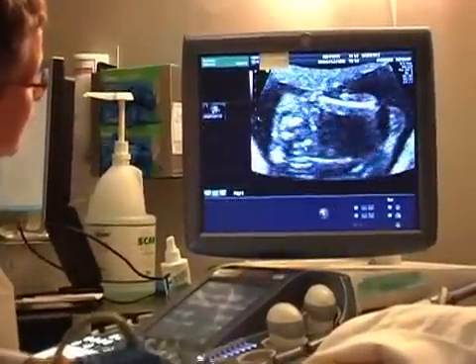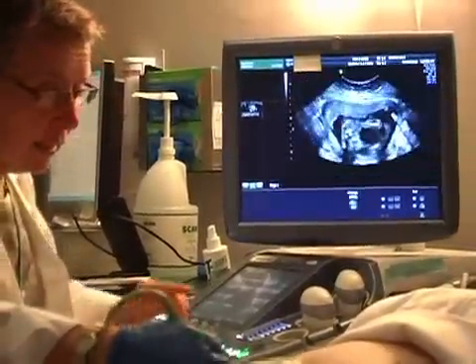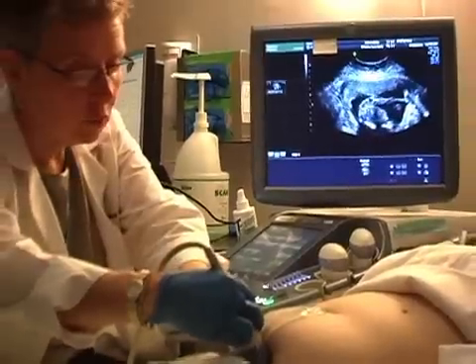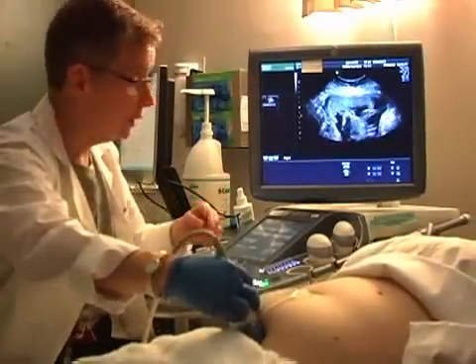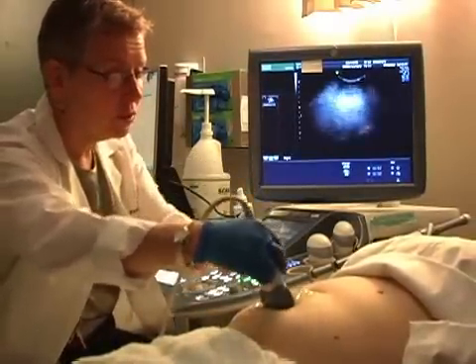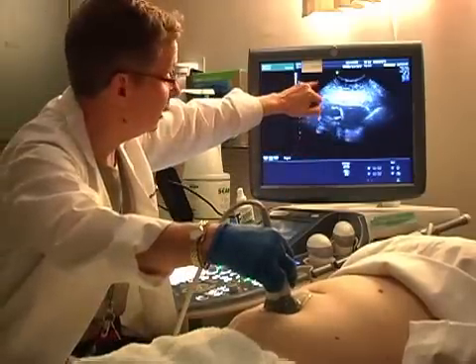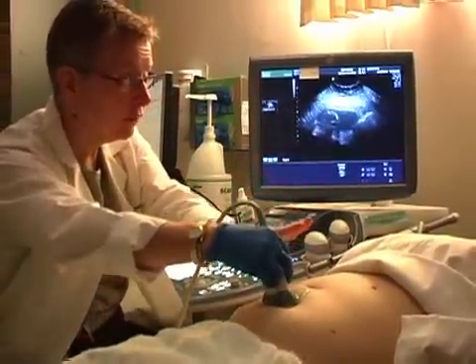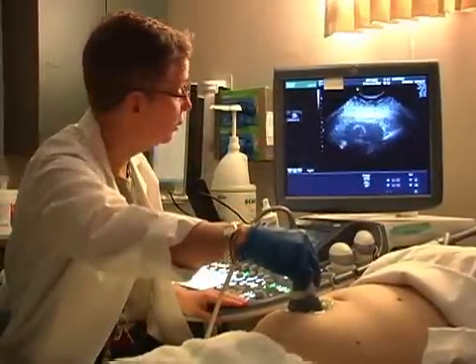The next thing I'm going to do — I have my probe oriented transverse, and what that means is that I have the ridge on the probe toward your right side. When the ridge on the probe is toward the right side, your right side is on the left side of my screen. It's the same as if I took your abdomen and put it directly up here. So orienting transverse, that's what it looks like.